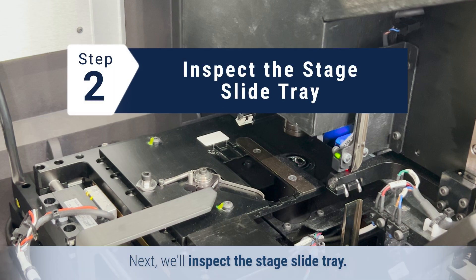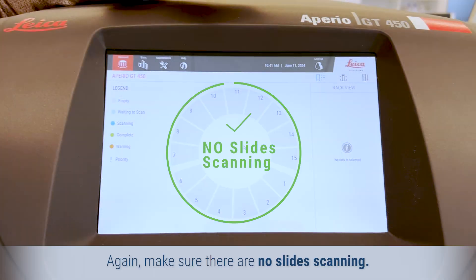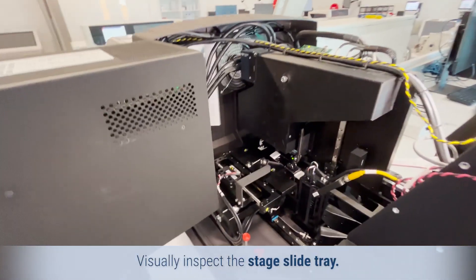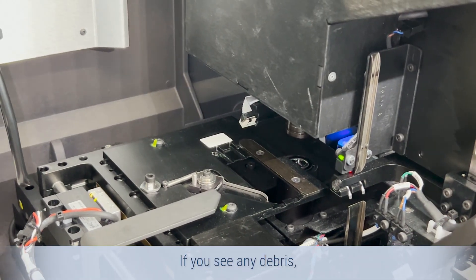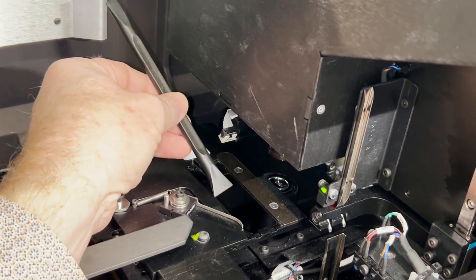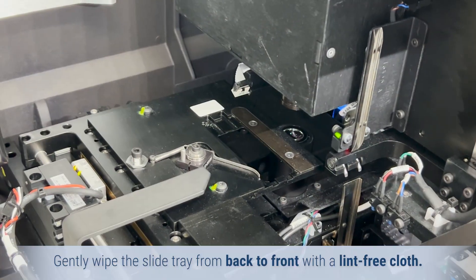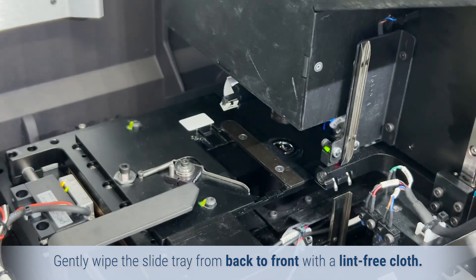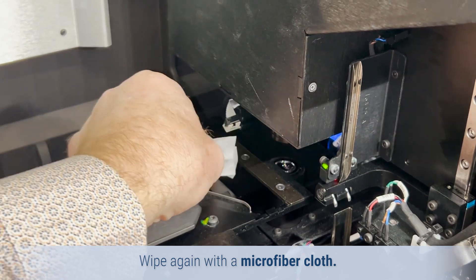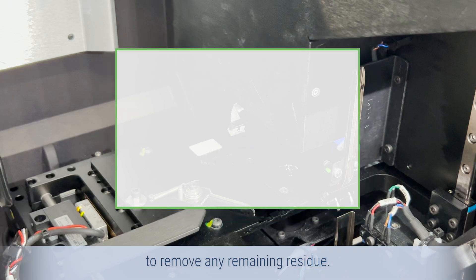Next, we'll inspect the slide tray. Make sure there are no slides scanning. Open the scanner interior and visually inspect the slide tray. If you see any debris, use a plastic scraper to remove it. Be careful not to bump the LED or objective. Gently wipe the slide tray from back to front with a lint-free cloth, then wipe again with a microfiber cloth. If needed, use a gentle solvent like alcohol to remove any remaining residue.